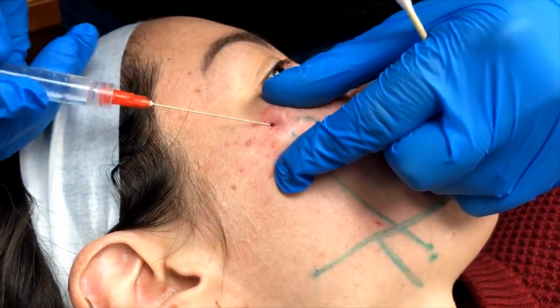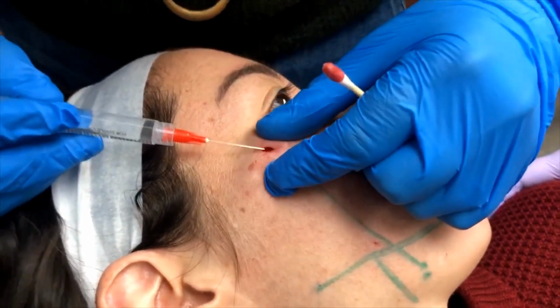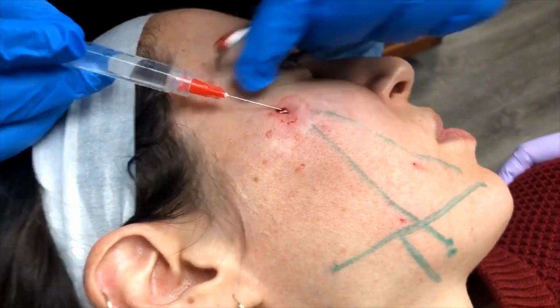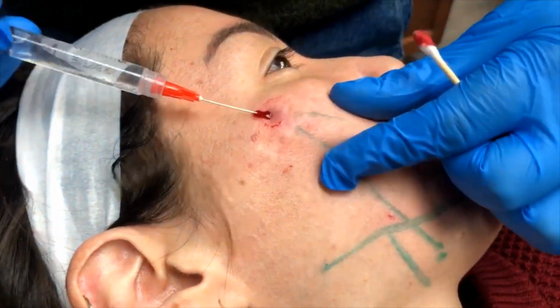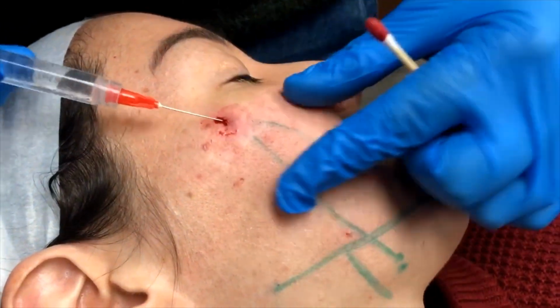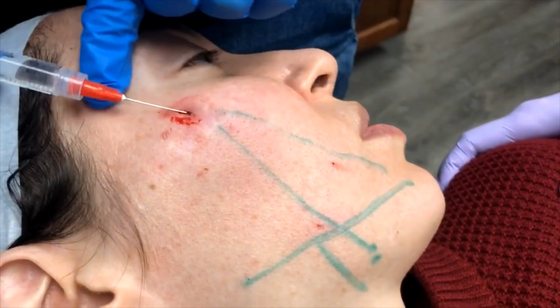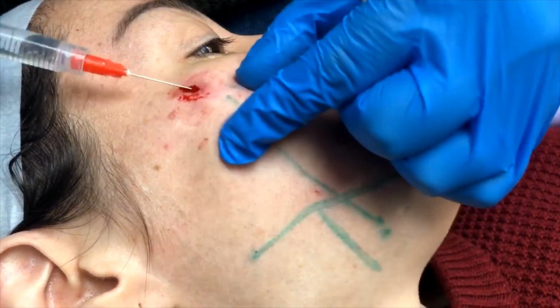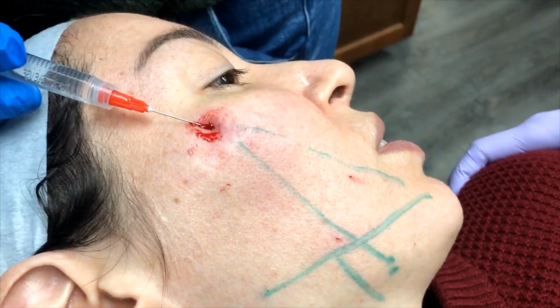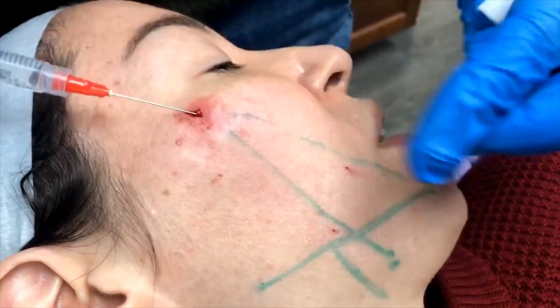Now we are going to use AFI exclusive technique, a ComfortTox microcannula, and we're going to get her numb along the track. But what we're really doing here is something called pre-tunneling. And this pre-tunneling, again, is going to put us exactly in the right plane. Now, I want you to watch how we manipulate this microcannula different than everybody else. We never force it through. You see so many microcannulas that get forced through the tissue and just rip the tissue. It's supposed to be non-traumatic, or very atraumatic here, and that's the way it is with our techniques here.